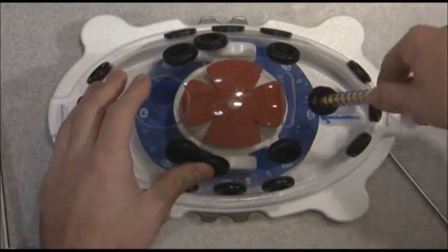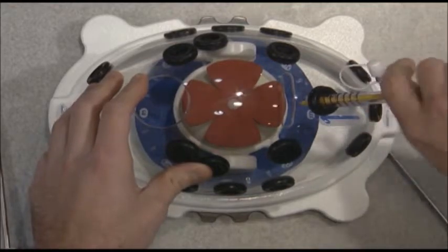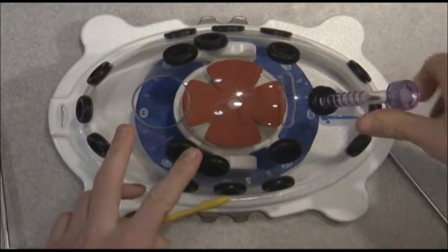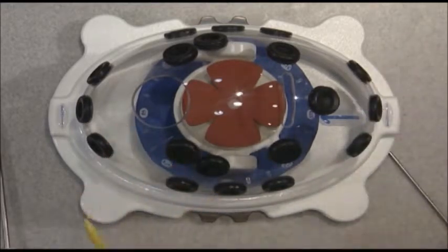So for this task, it can be done with or without a cannula in the workstation. I'd just like to demonstrate that this workstation does accommodate a cannula if you would like to practice working through a cannula. And you can do this for the various tasks of knot tying or anchor placement. Because I'm going to be using that portal for multiple things, I'm going to leave it without a cannula for this demonstration.